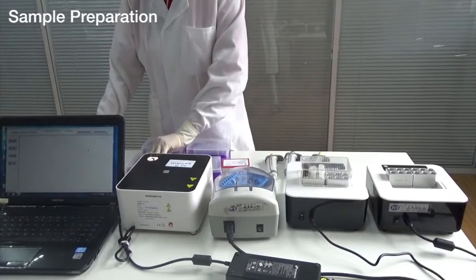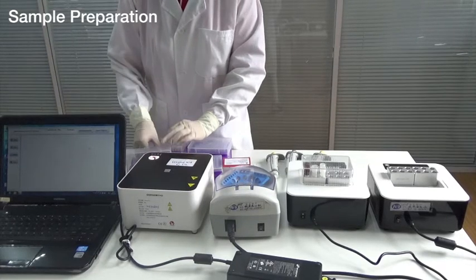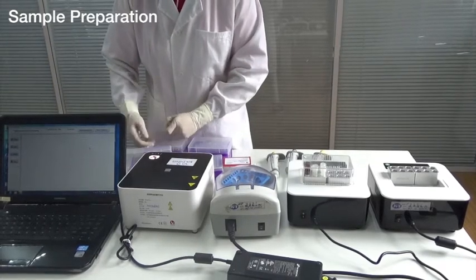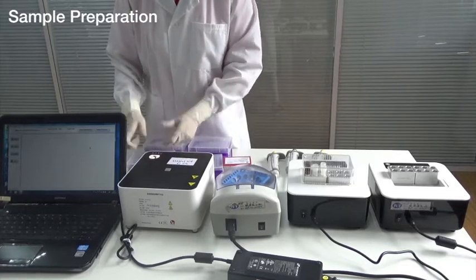First, add the swab suspension into a 2 mL microcentrifuge tube. Centrifuge the tube for 5 minutes at 13,000 rpm.